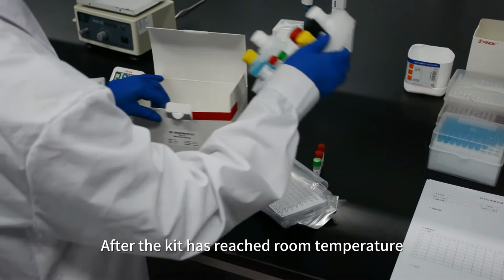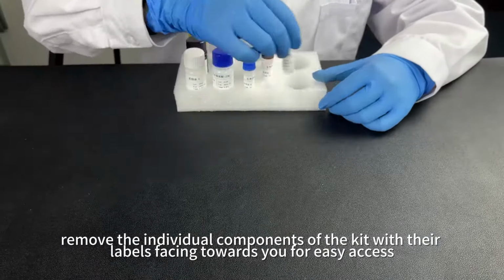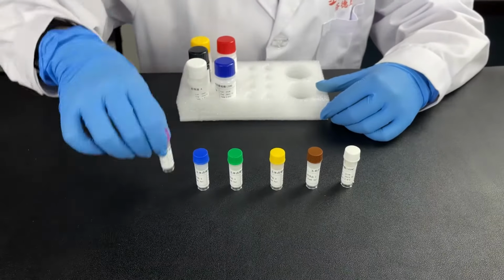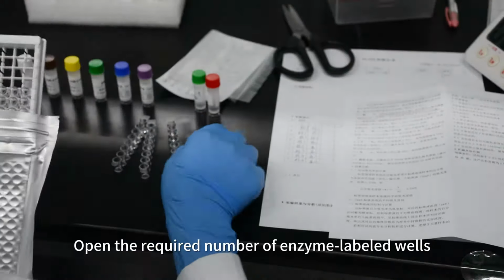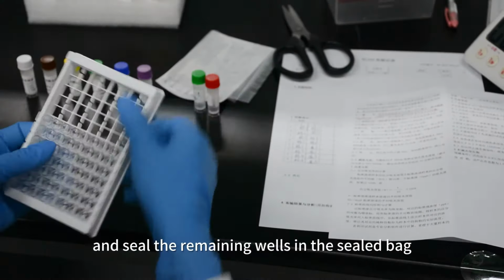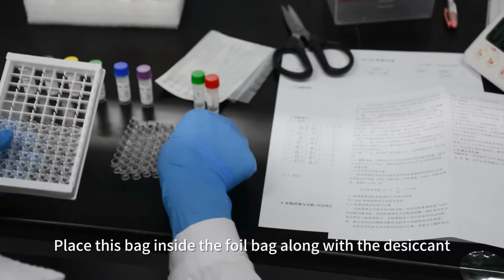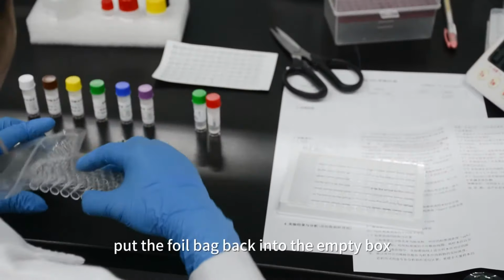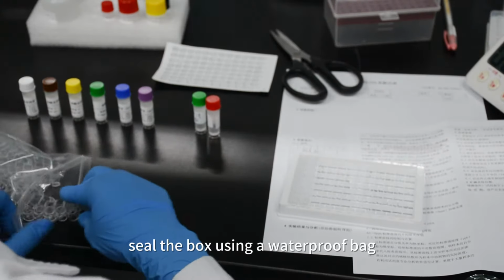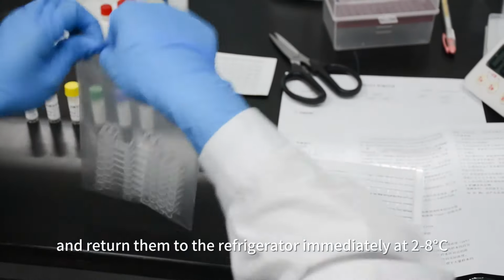After the kit has reached room temperature, remove the individual components of the kit with their labels facing towards you for easy access. Open the required number of enzyme-labeled wells, and seal the remaining wells in the sealed bag. Place this bag inside the foil bag along with the desiccant. Then, put the foil bag back into the empty box, seal the box using a waterproof bag, and return them to the refrigerator immediately at 2 to 8 degrees Celsius.